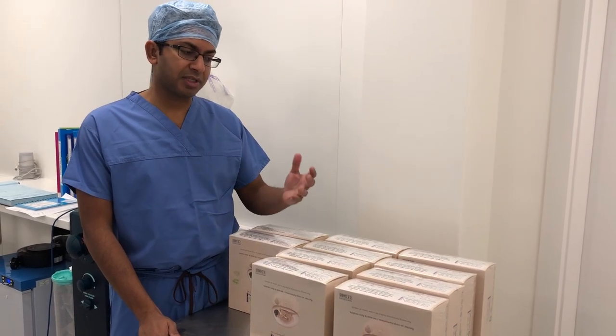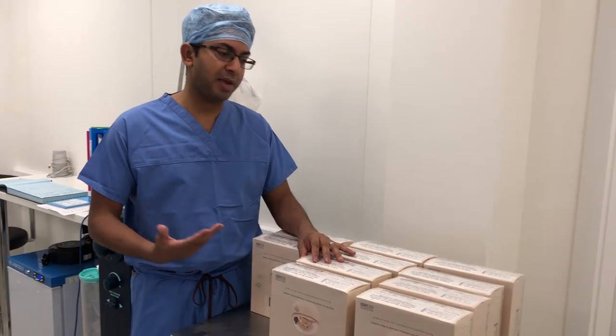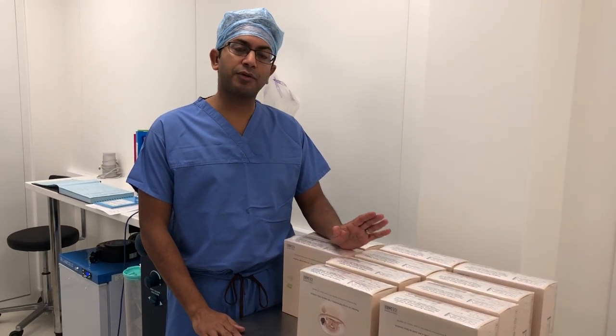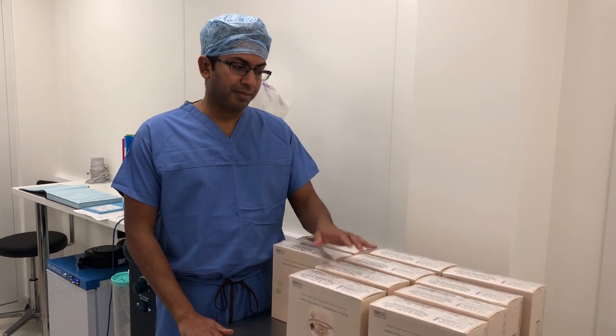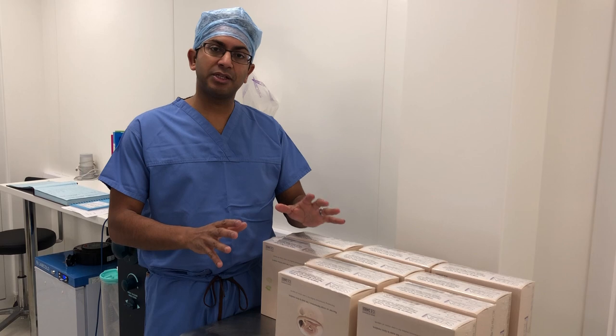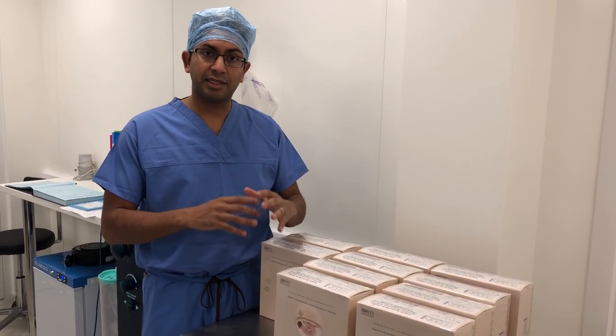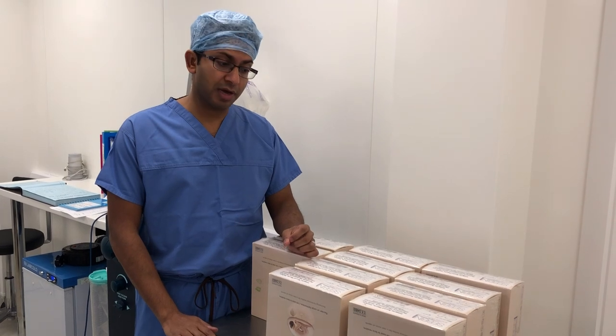She used some pre-operative sizers to work out what size she wanted to be, and she's opted for a 345cc implant. Having said that, I often get a range of implants available because it depends on what the breasts look like and the tissue dynamics to work out what breast implant is most suitable for her.